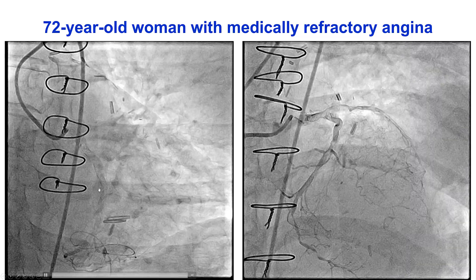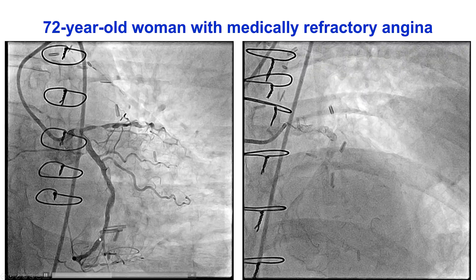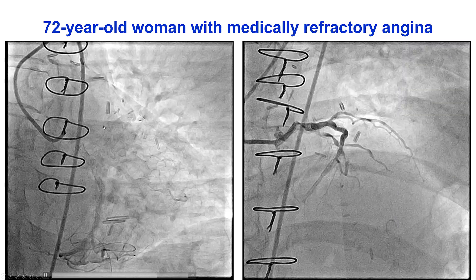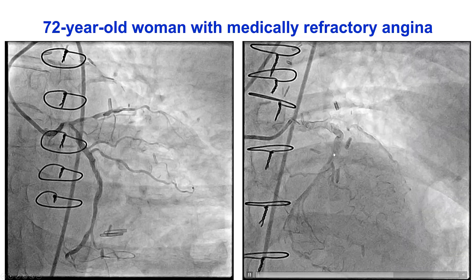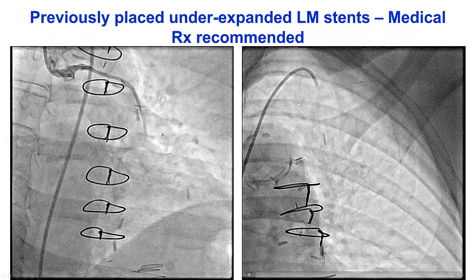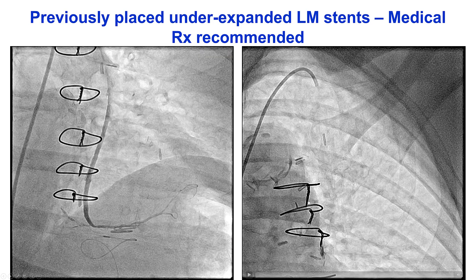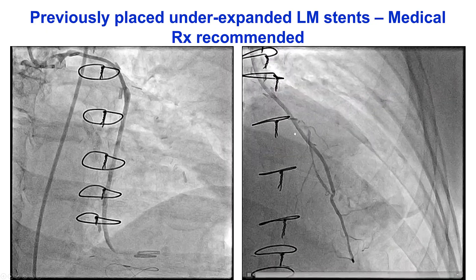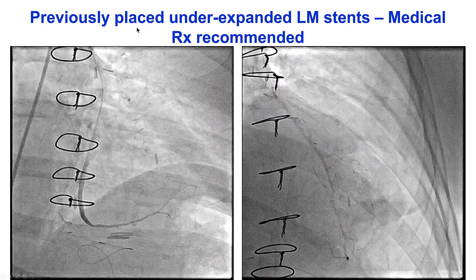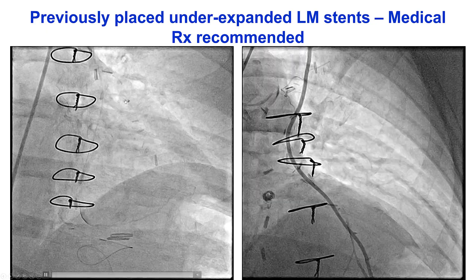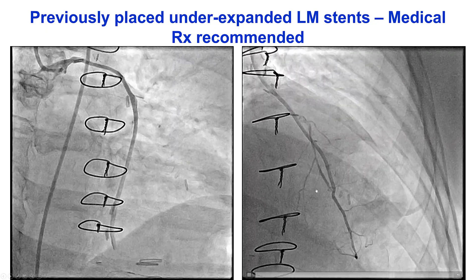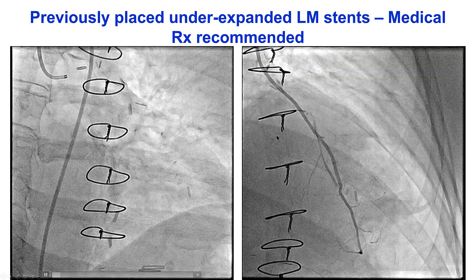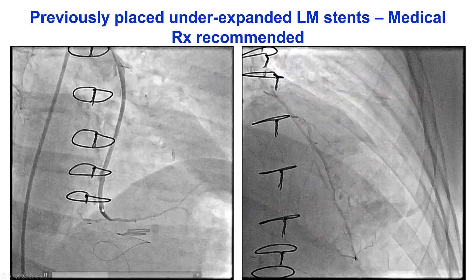She has a left dominant system. We can see that the left PDA is being supplied by the left main, as are the first and second obtuse marginal branches as well as the proximal LAD. She had a patent saphenous vein graft to the obtuse marginal and a patent LIMA to LAD. The patient was recommended to continue with medical therapy under the assumption that the LIMA and the SVG to OM were supplying adequate perfusion to the anterior wall and the lateral wall respectively.